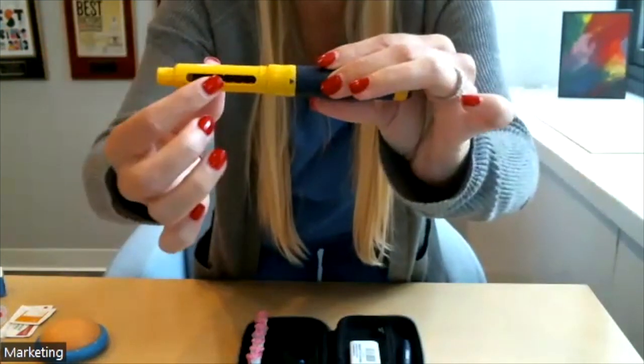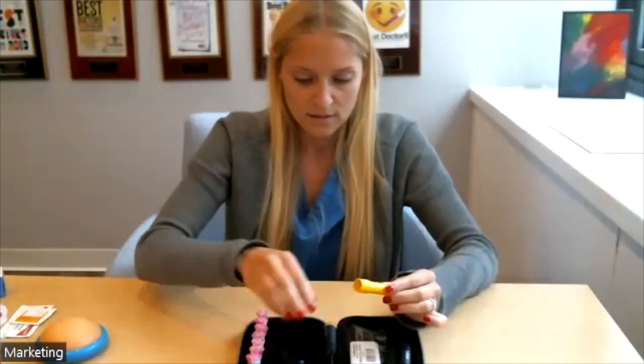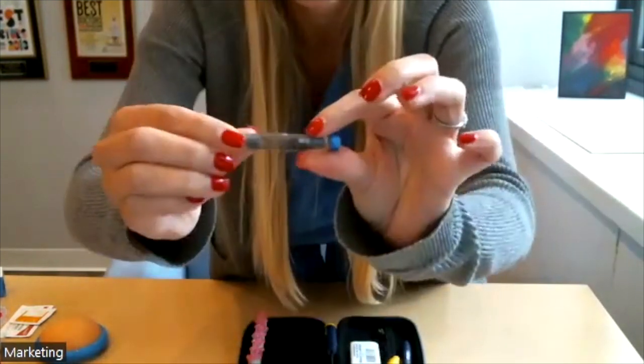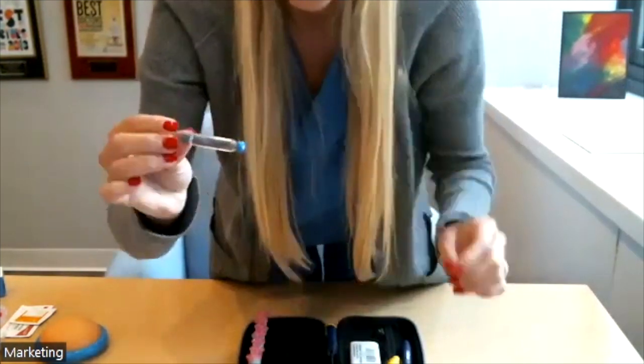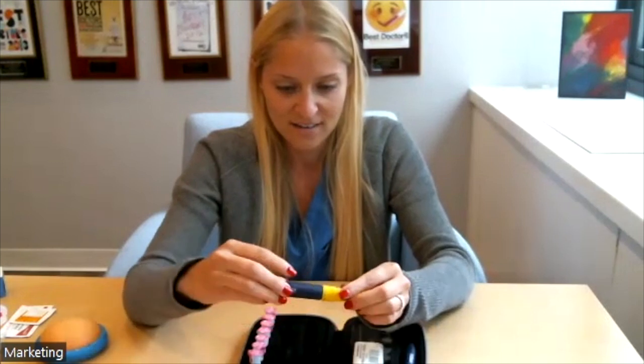When you open it, this is a blank cartridge with nothing in it — you'll just see a little plunger on the inside. It comes with a screw-off top. You'll take your medication, put the blue side down into your cartridge, and push the plunger in, then screw it on.